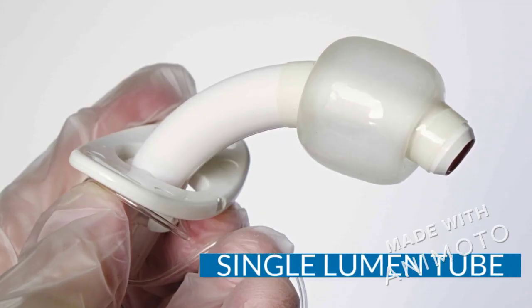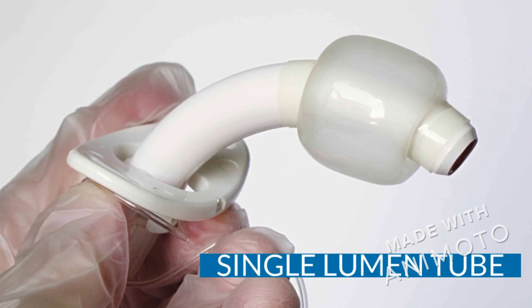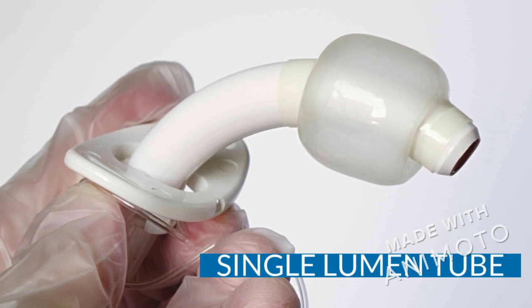The second type of tube is a single lumen tube, that is, it does not have an inner cannula and it also does not ensure a patent airway because of the absence of the inner cannula.